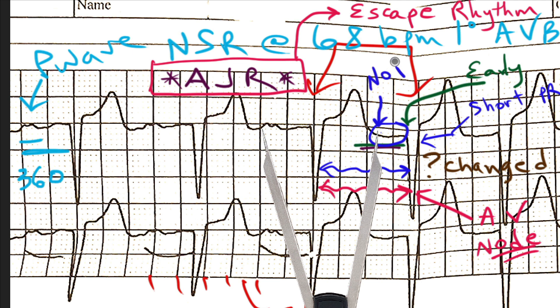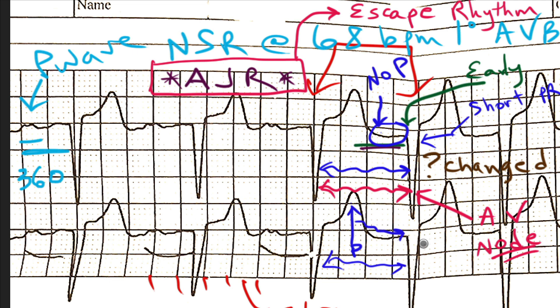But there's no P. That actually gives us the answer here. Because it'd be highly unlikely for there to be a sinus pause, but then the QRS complex comes sooner than you'd expect. So it's not an escape beat. It came from somewhere. And the answer is there must be a P wave here on this T that now conducted with a very long first degree AV block, giving rise to this QRS complex.